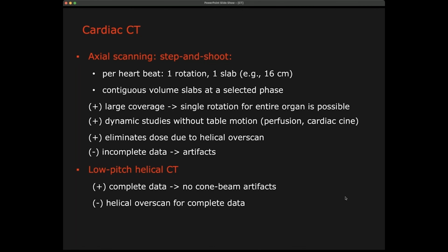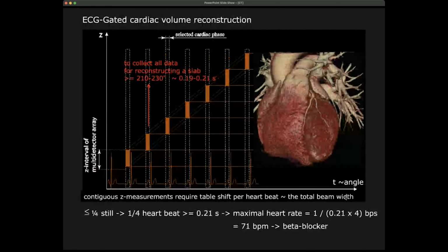heart during the contraction. So that means that we need to do some tricks in some ways, because the scanners are just not fast enough. So we cannot scan so fast that we rotate, or have a full projection, while the heart is not moving. The heart is moving so fast that it will have moved during the rotation. So that means that we have to find a way to do proper timing, to know not only from which position a projection comes, but also from which phase within the cardiac cycle the projection comes.